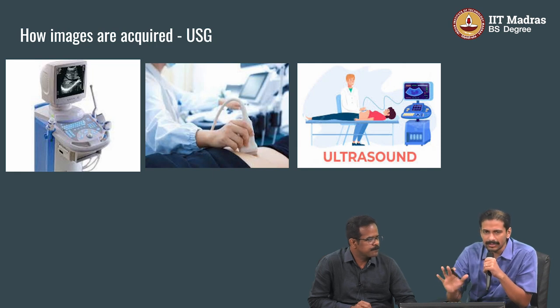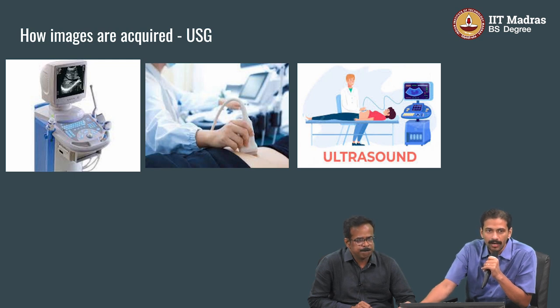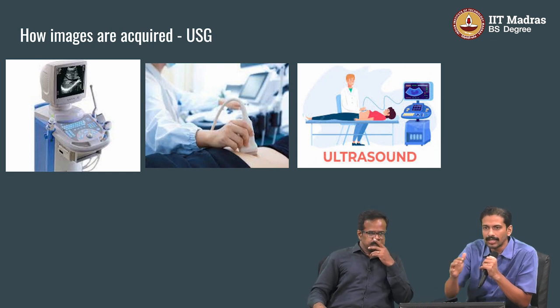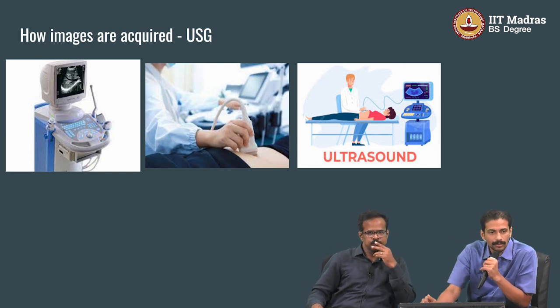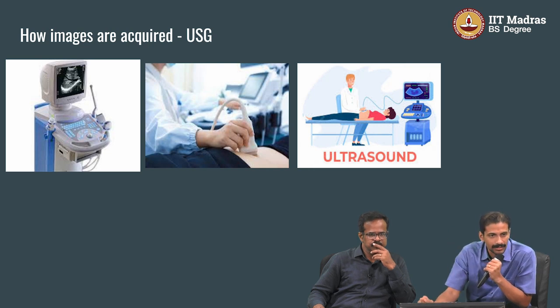Ultrasound, I'll not stress much on ultrasound. Ultrasound is based on a totally different technology. Till now, we talked about X-ray technologies. X-ray, fluoroscopy, CT scan, all these are X-ray technologies, radiation technologies. Ultrasound beams are based on acoustics, the sound. Ultrasound is anything more than 20,000 hertz. But our medical imaging devices use something in the range of 1 to 20 or 25 megahertz of frequency.